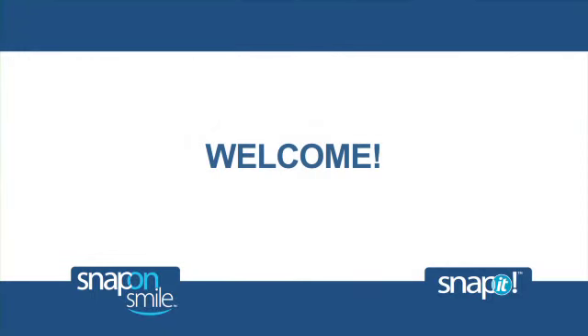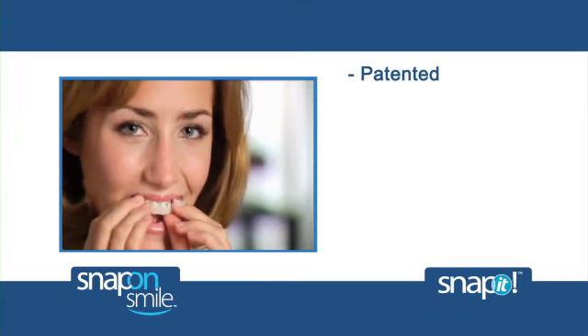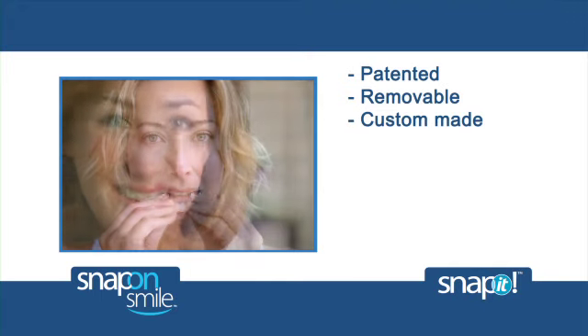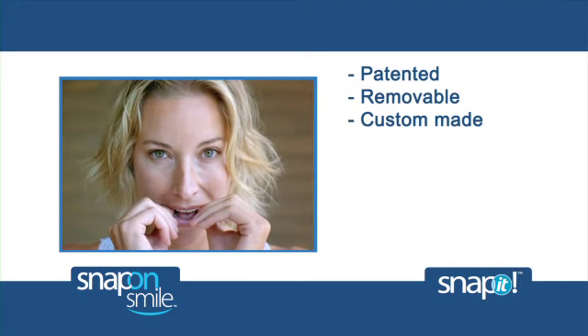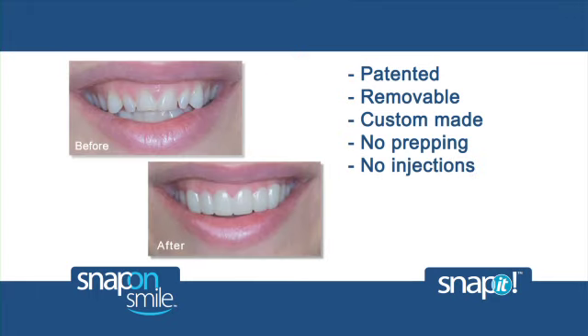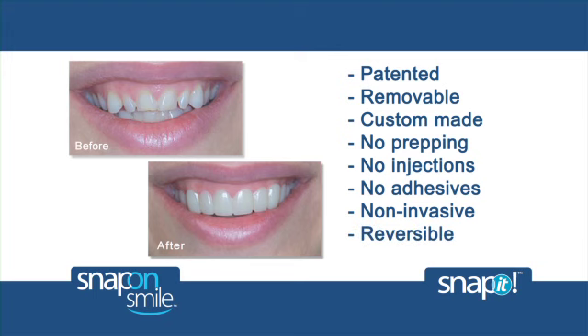Welcome. In the next few minutes, we will present you an overview of Snap-On Smile and Snap-It. Patented Snap-On Smile and Snap-It are removable custom appliances that simply snap over a patient's natural teeth. Typically no prepping is required, so no injections and certainly no adhesives. This is a non-invasive option that's easily removable and completely reversible.